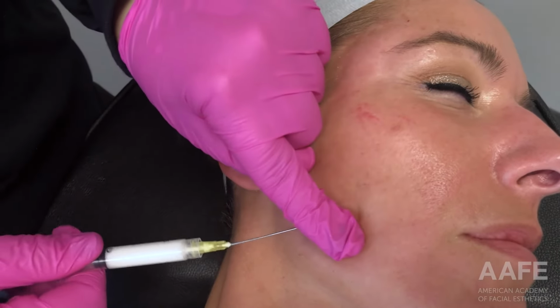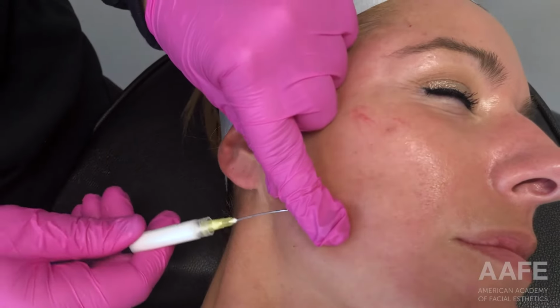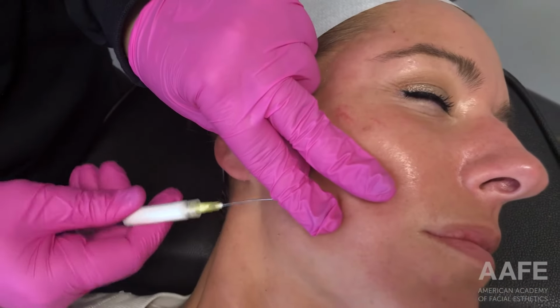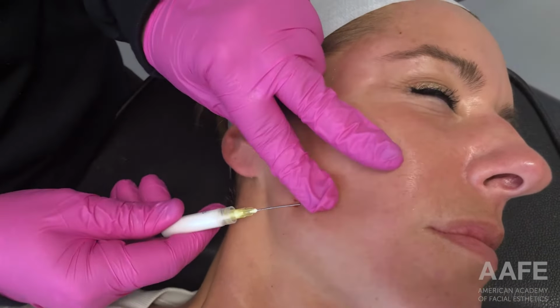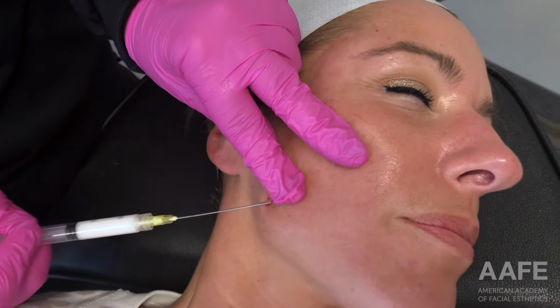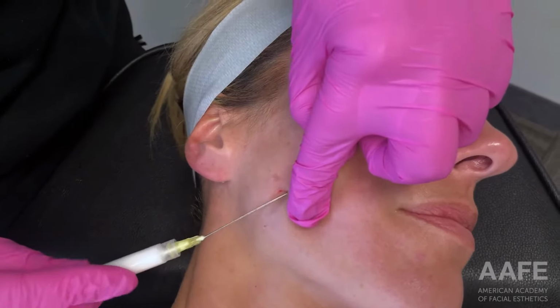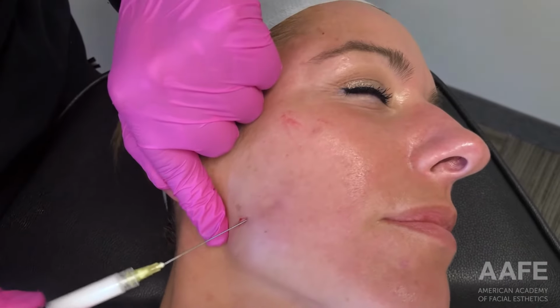And then away you go. So in this treatment, we are looking to be immediately subdermal. And so you can see that once you get in and out of that plane, generally speaking, you can sort of glide in and out pretty easily to do the fanning of the product.